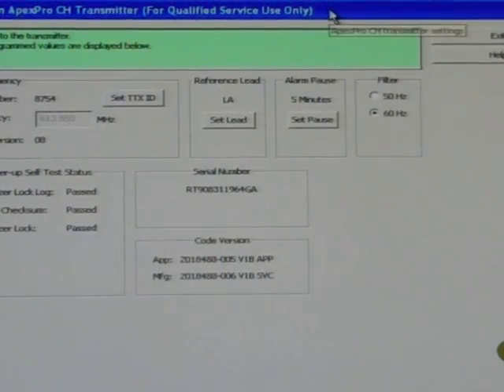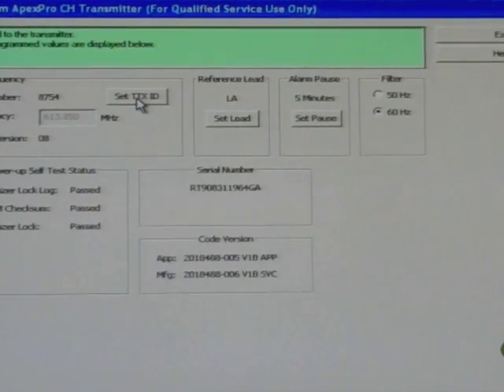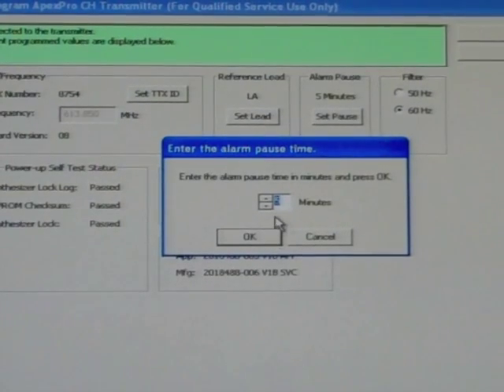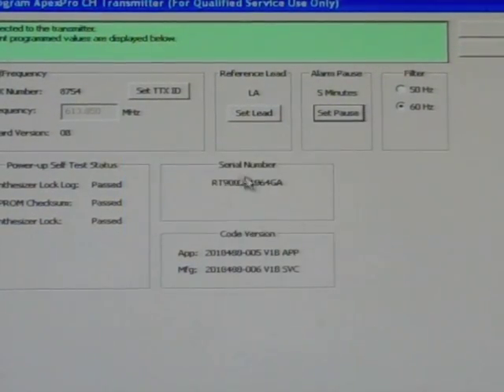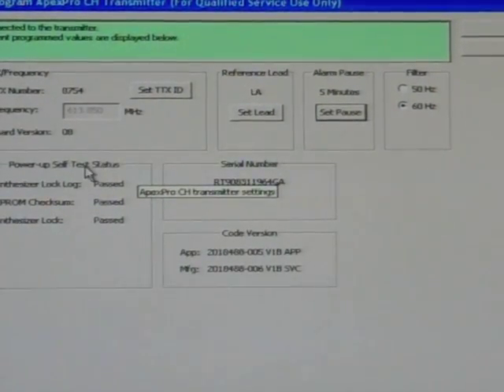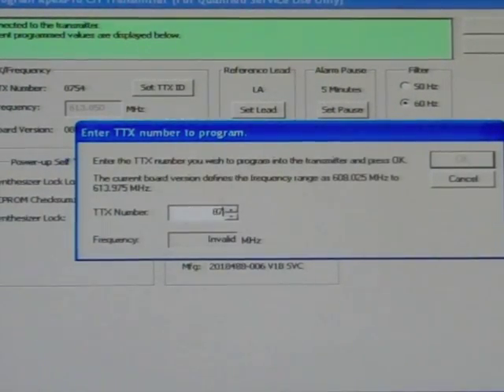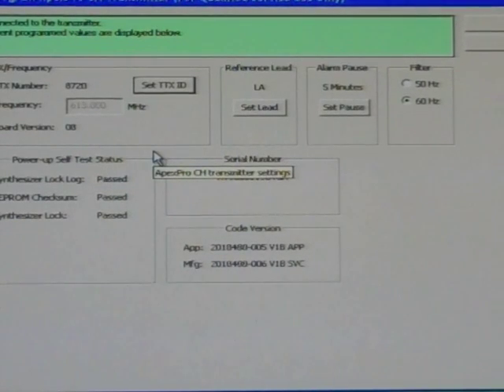On this screen, while it's communicating, you have an opportunity to reset your TTX ID. You can change your reference leads. You can set your pause time if your transmitter will shut off if there's no activity after X amount of minutes. And you can even go as far as to reset and clear failures if they should pop up in your power-up self-test statuses. So first on TTX ID, you just click, enter in your appropriate TTX, hit OK, and that'll change in a few seconds.